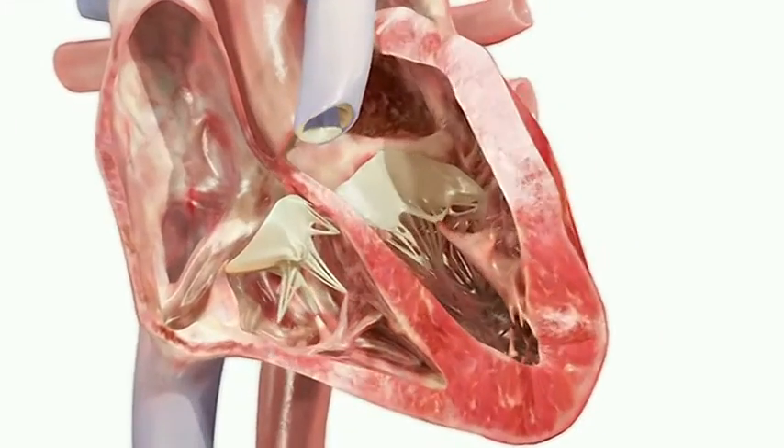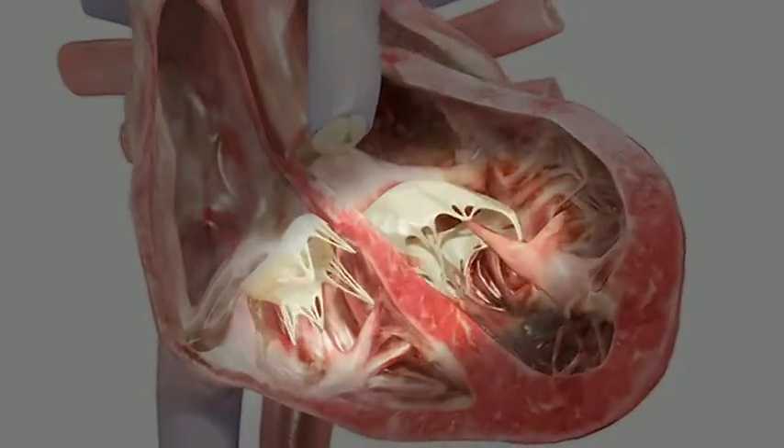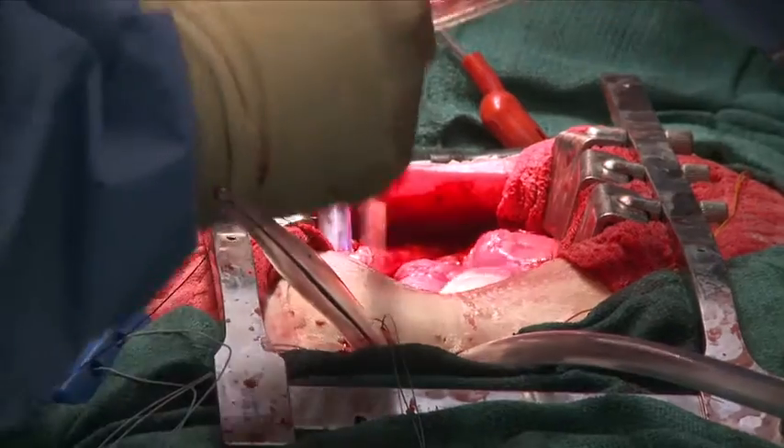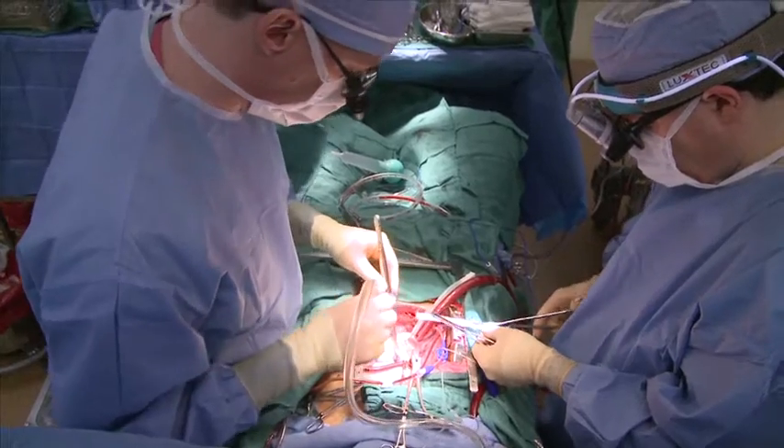Heart valves are held in place with string-like tendons that can stretch or break, keeping the heart from pumping properly. Until recently, repairing a valve required a highly invasive open heart operation in which the surgeon would have to temporarily stop the heart.